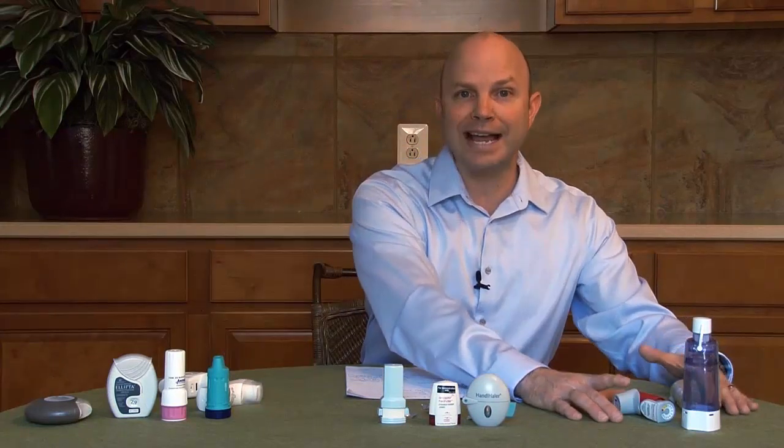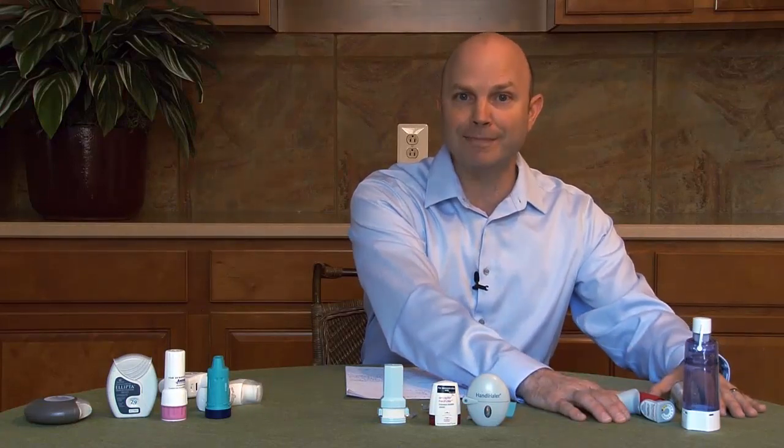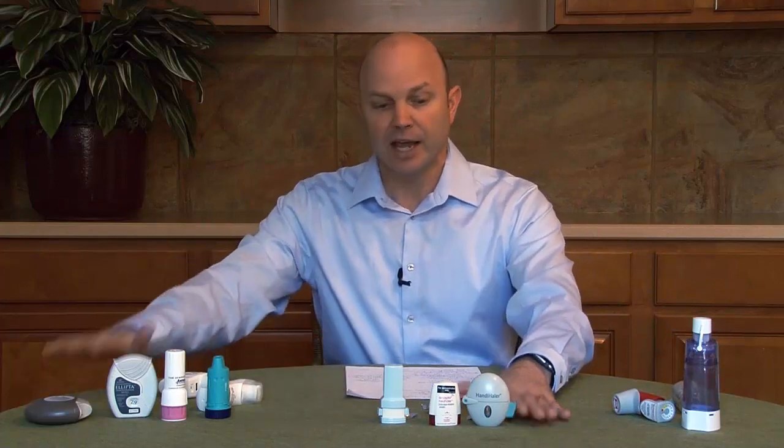In general, there are 3 different types of inhaler devices. We have our pressurized MDIs. This is a liquid form of medicine. We have our dry powdered inhalers. This comes in a single dose dry powder inhaler and a multiple dose dry powdered inhaler.